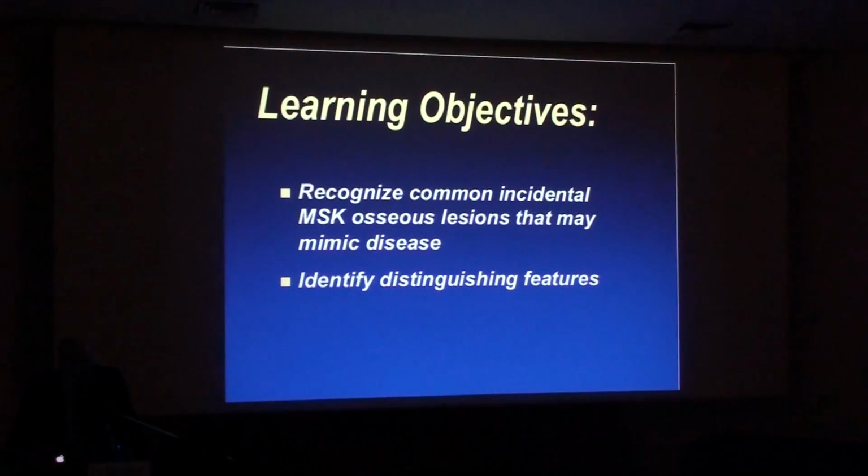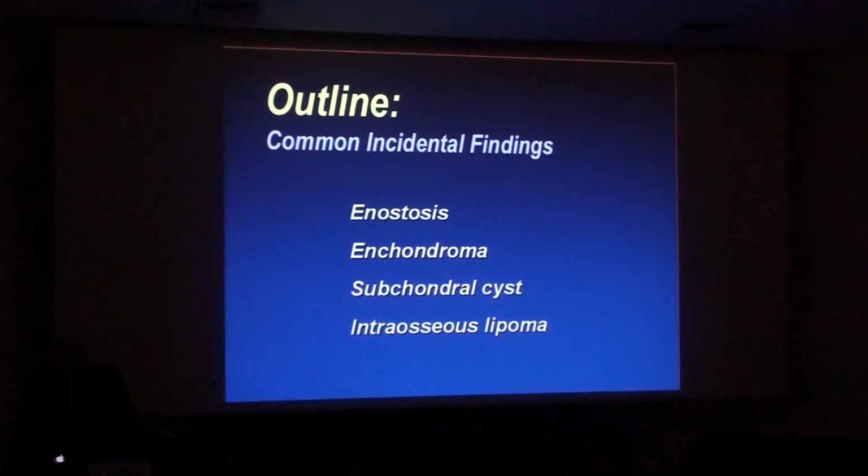And the specific example is the 50-year-old that comes in with the incidental, quote, bone island, and your colleague says to you, well, could this be a blastic metastasis? How do you distinguish things such as that? And those lesions that I'd like to address are those listed here.